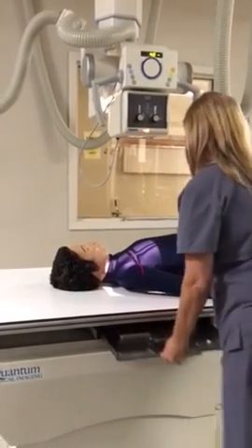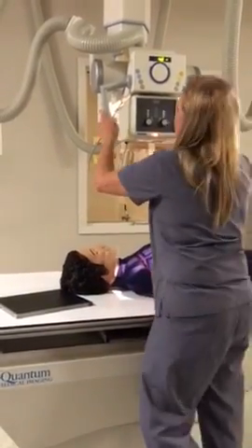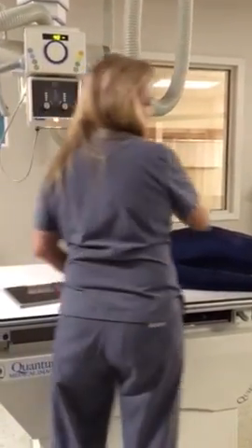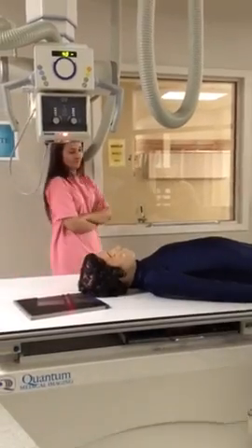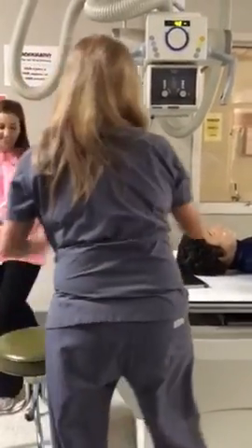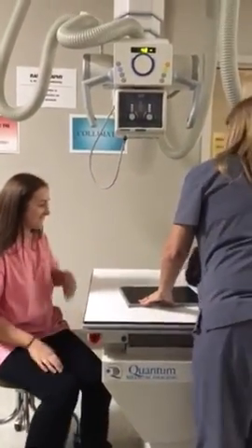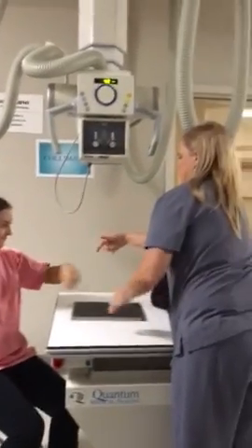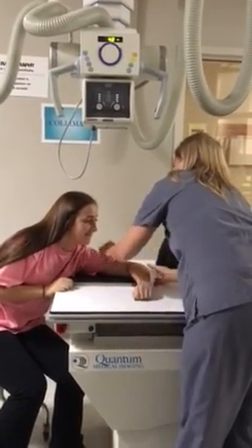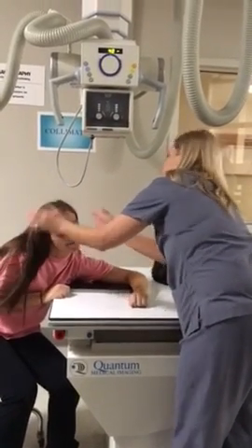Alright, axial. Superior, inferior. Come on, everything's gone. Stool. Let you have a seat. You're going to be the patient. Okay, so let's have this one. Lean this away. Move that head out of the way.